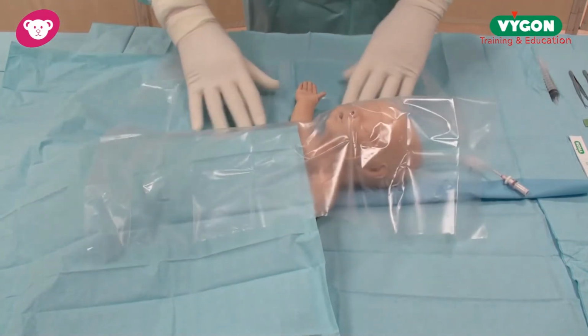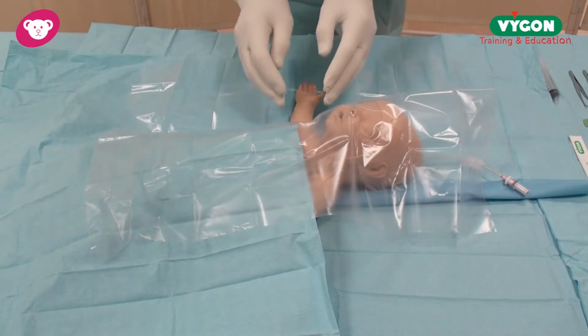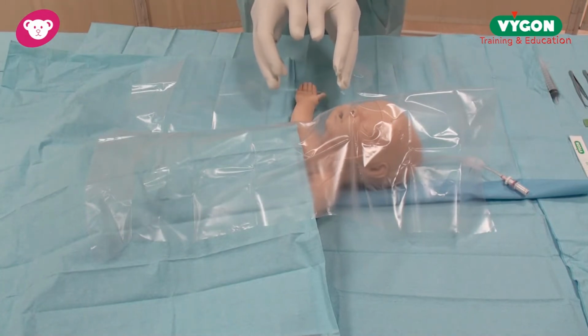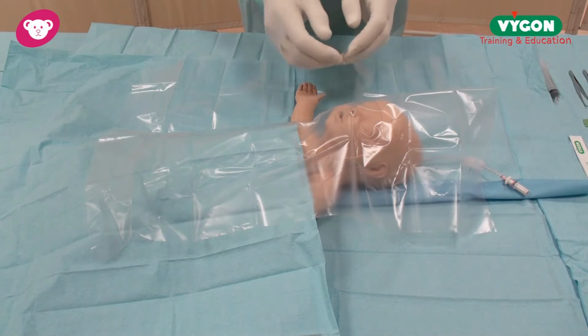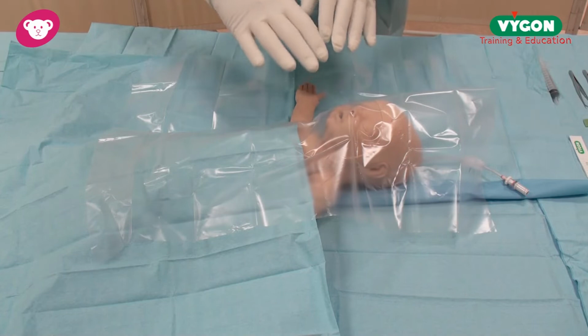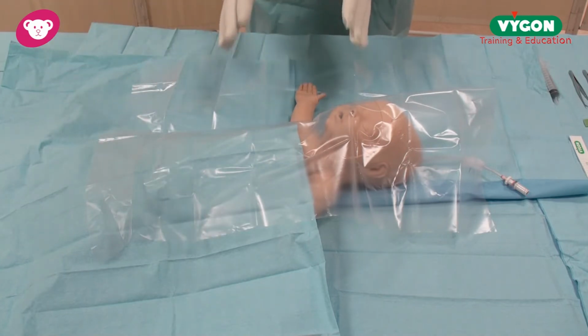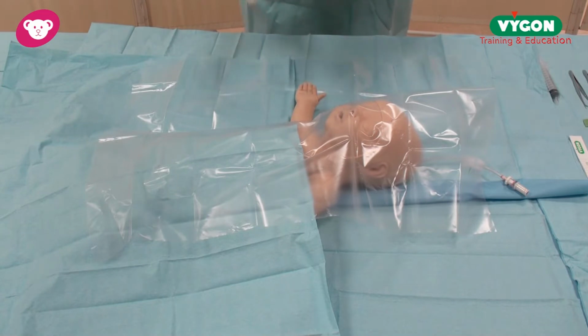And as you now can see, we have maximum barrier precautions. The baby's arm is now ready for PICC placement. We can see the baby. We can also see the baby's colour. We can also keep the baby's heat in. The rest of the baby is completely covered, meaning we have now maximum barrier precautions. So we are carrying out the guidelines that we hope will reduce catheter-related bloodstream infections.